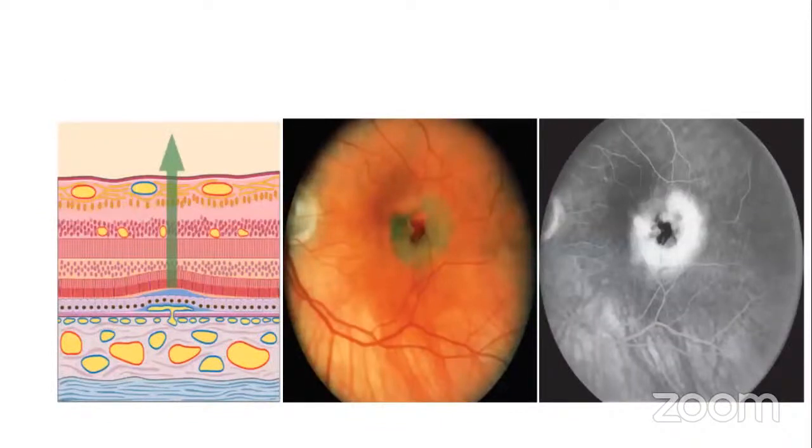So always try to find out what is happening and why it is happening. That's one of the basic ways of knowing what's going on. So I'll use this diagram to explain what's going on here. And most of us would have made the diagnosis in our mind. So this line here is meant to represent the Bruch's membrane. Okay. These cells with brown dots are the RPE.